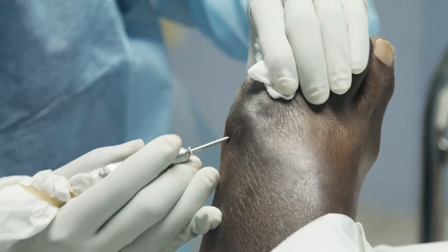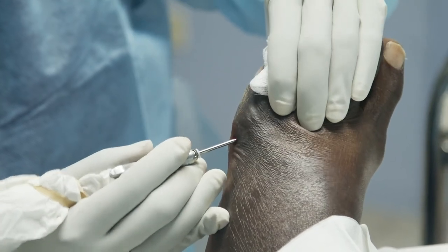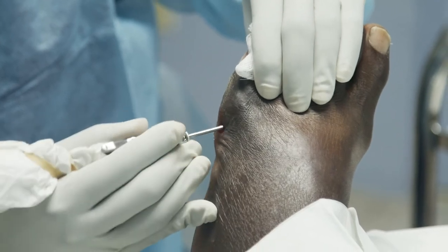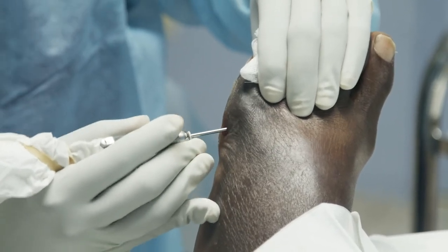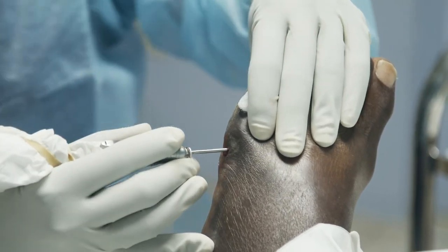And in the joint again. And I'm on that spot. You can see that. See the joint popping up? Okay. And I'm going underneath. Hear that sound? I'm on the money. Okay, do you feel anything there? No.